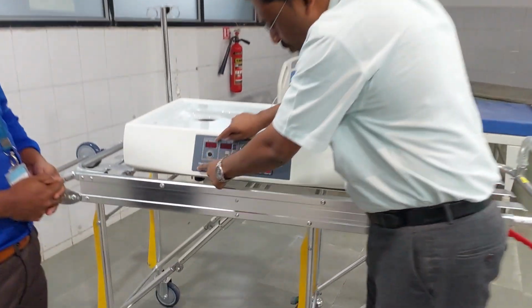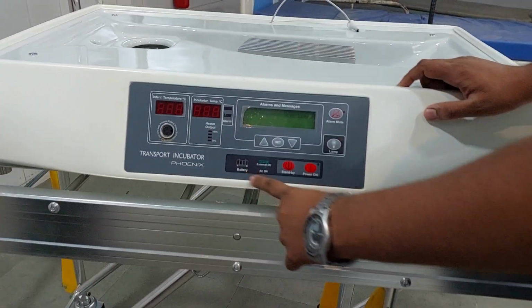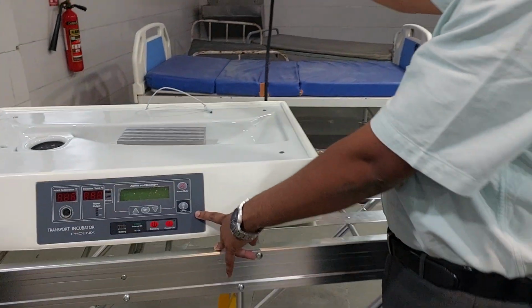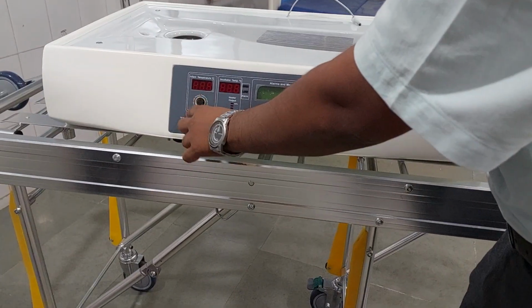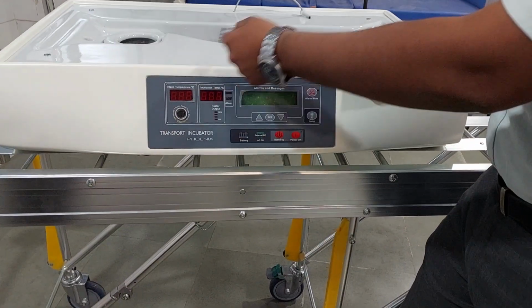And this is the control panel they have provided. On the control panel you can observe it will give you the battery status, and whether the external supply is DC or AC. This is standby, power on. They have provided one lamp; to switch the lamp on and off you have to use this switch. This is the alarm, right? And this is the connection to connect the temperature probe. And here you will get the actual incubator temperature.